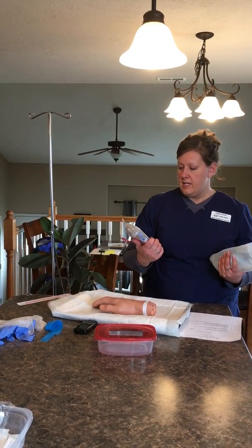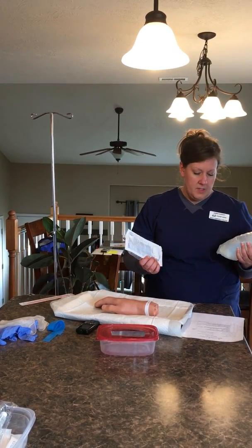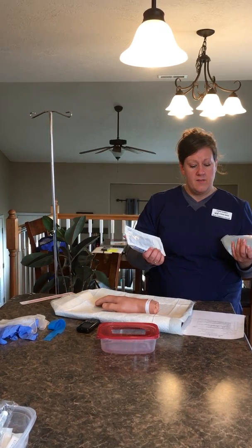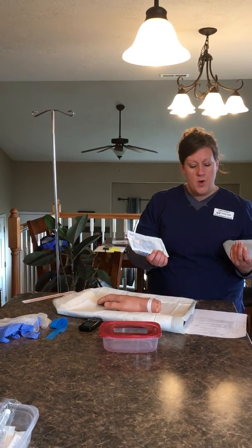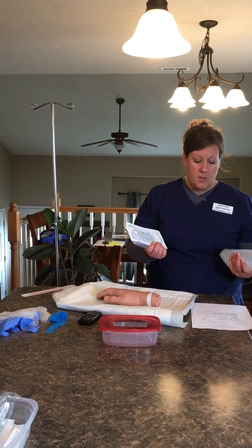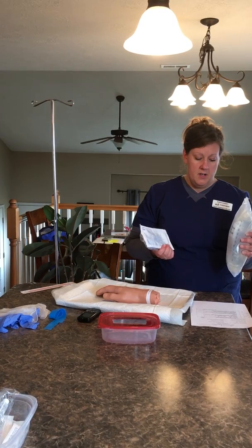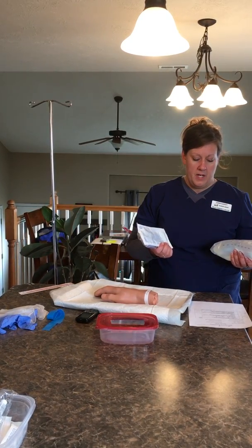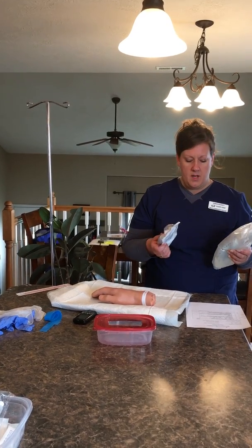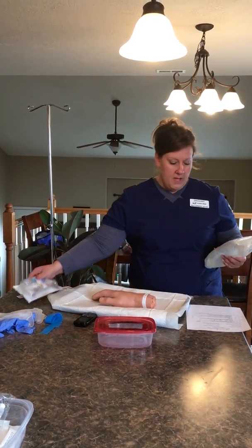Our solution set is 10 drops per milliliter, and with 1,000 milliliters, that will be 167 milliliters per hour, which breaks down to 2.8 milliliters per minute. With the 10 drops, that gives us 28 drops per minute, which is about 7 drops per 15 seconds. When I hang it, we will check that it's administering correctly.